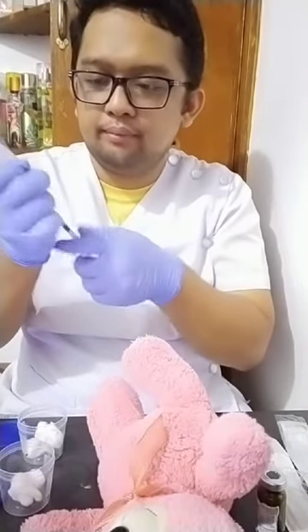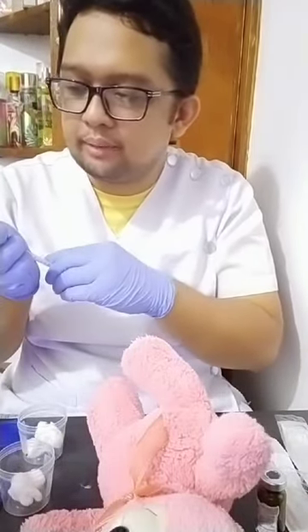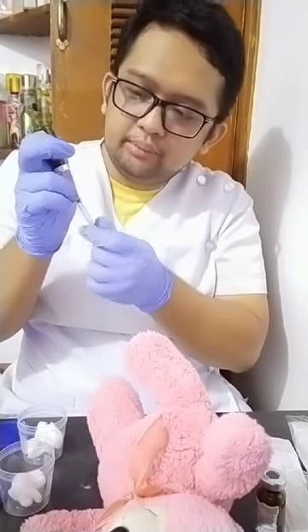So intramuscularly, in preparing, we use sterile water for diluent, assuming that it is powdered form. Okay, aspirate the diluent, incorporate it to the powdered form vaccine, confirming the expiration date and the name. Mix it well, then re-aspirate it. The proper dosage is 0.5 ml.